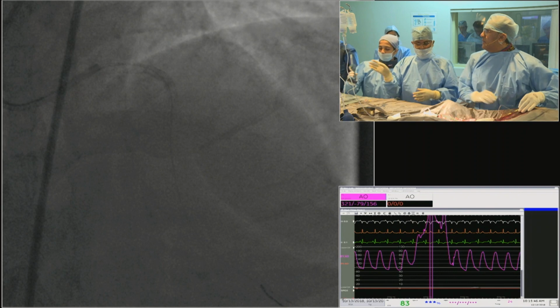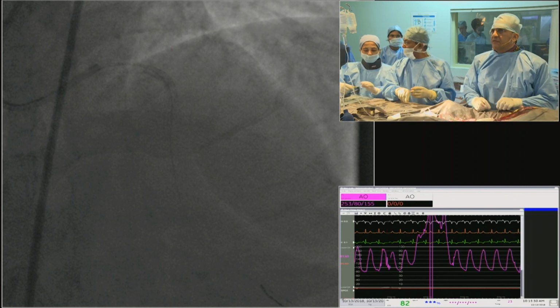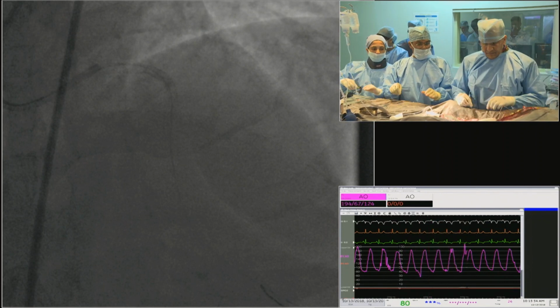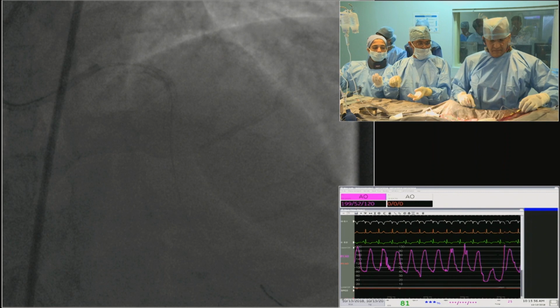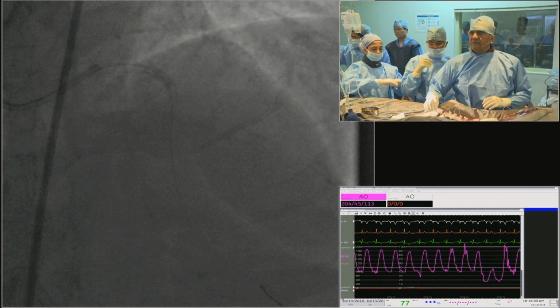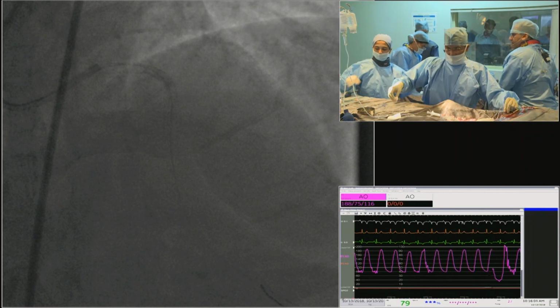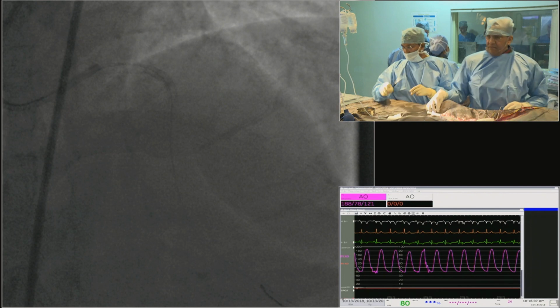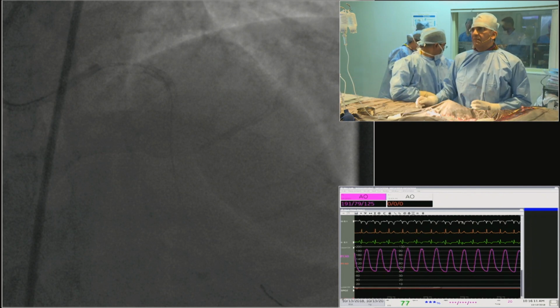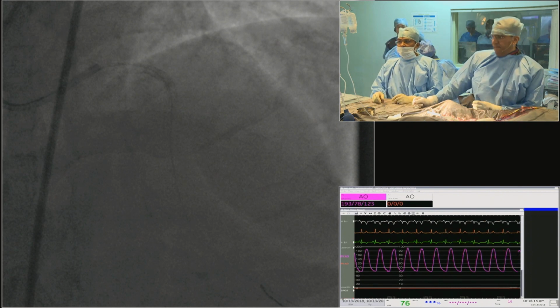Can I have a 3.0 balloon to dilate it, yes, before I do an IVUS? I think there was some talk about the radial strength of the stents as you overexpand them. What I have seen in bench studies is that if you overexpand a stent, the usual belief is that if it's a 3.5 stent, you expand it to 4 or maybe a little over 4, and the radial strength will decrease.